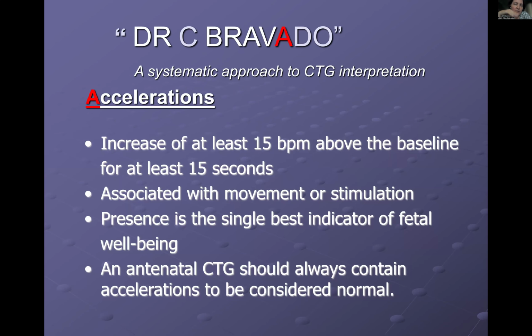Now, the accelerations, so it's different from variability. And when we see accelerations, we're happy because they are usually associated with movement or with stimulation. And it does show that there is fetal well-being, right? That the baby is happy. And it basically is when you have at least an increase from baseline by 15 beats per minute for at least 15 seconds. Now you can have a bigger rise than 15 beats per minute, and a longer acceleration than 15 seconds. But to clarify, those are the minimum criteria.